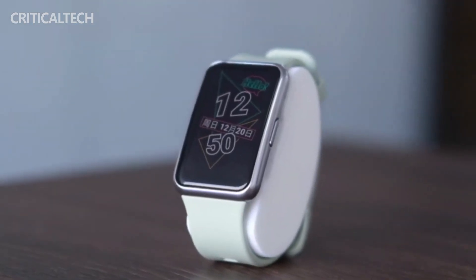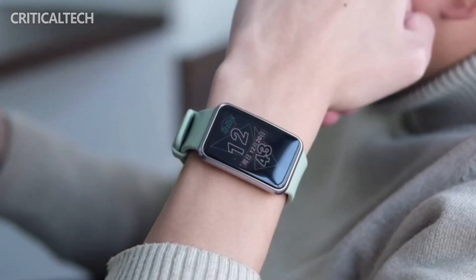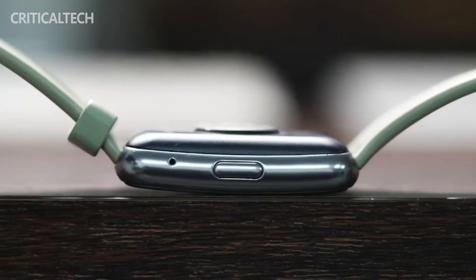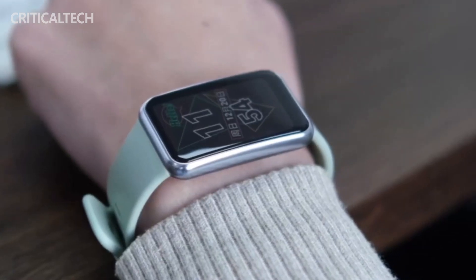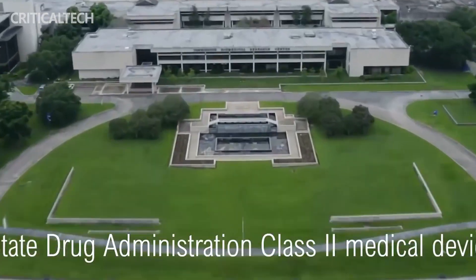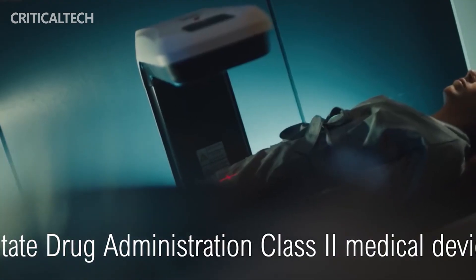However, we are yet to learn whether the Watch D will come equipped out of the box with all of the accessories it needs for its killer feature: blood pressure monitoring. The intriguing feature has already been teased on multiple occasions and, judging by the official renders, will likely be the most prominent selling point of the wearable. Thanks to a leaked user guide, we know that the feature will work with the help of an inflatable strap that attaches to the body of the Watch D and is available in two different sizes.